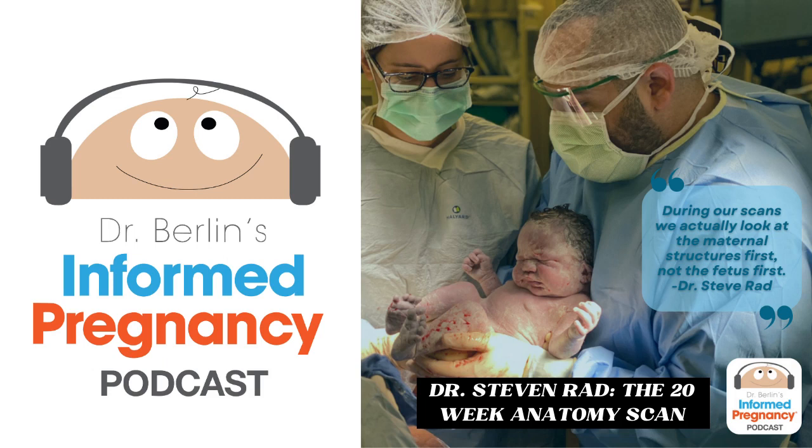Yeah, so the typical ultrasound, it's an advanced machine. Not to name brands or advertise for anyone, but most sometimes use either a Philips or Samsung ultrasound, and that's internationally. We all use the same machines. Some, of course, are more up to date. It's like having the 2022 versus the 2023 car. It's like having a Ferrari or Lamborghini or Rolls Royce, a really expensive Mercedes, compared to a more basic car. The difference is, does your machine have the greatest resolution? That comes with the processors in the ultrasound machine, and also the ultrasound probe and the crystals it uses, versus a regular, basic ultrasound machine.